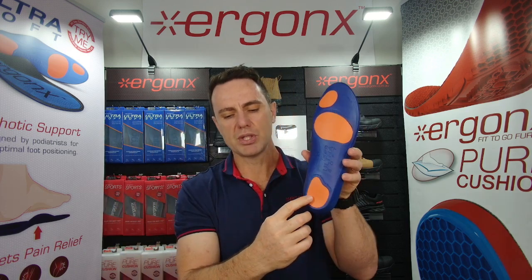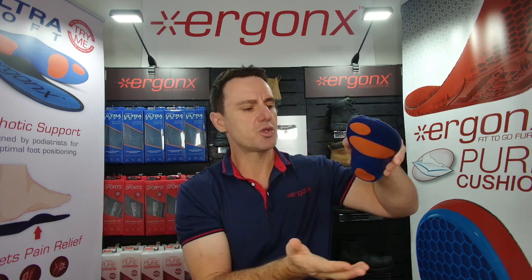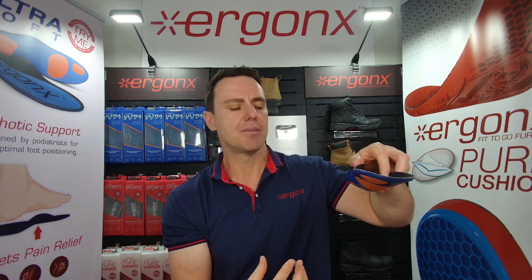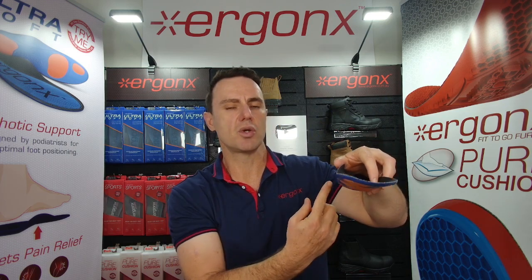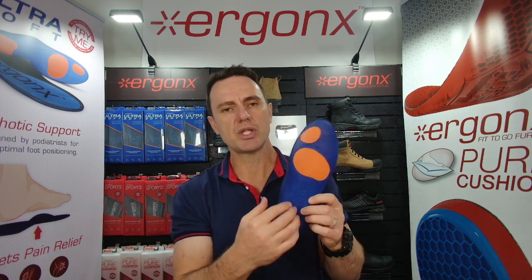We've also got Poron cushioning positioned in the heel and forefoot. As your foot strikes the ground, this helps cushion some of the forces that would go through into your heel bone, feet, and legs — forces the muscles would usually have to deal with by gripping and controlling the position of your feet. So cushioning the feet makes them more comfortable because they're working less.